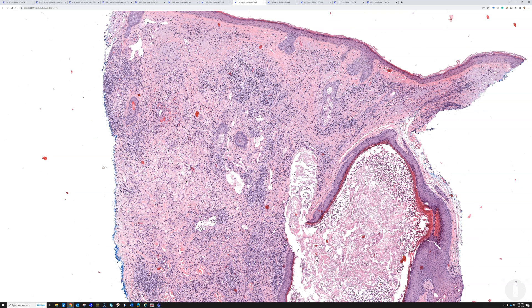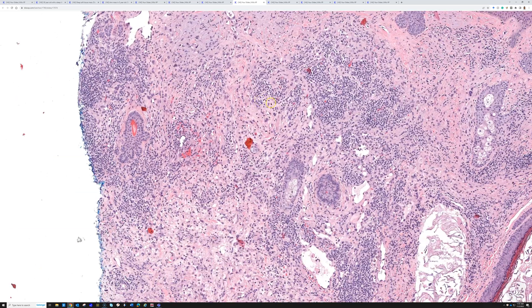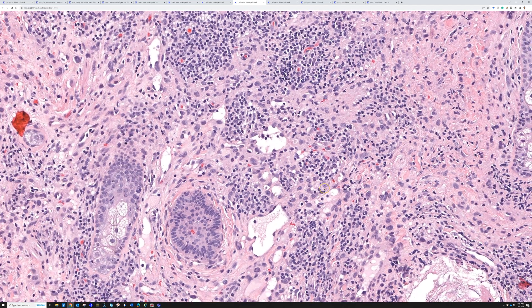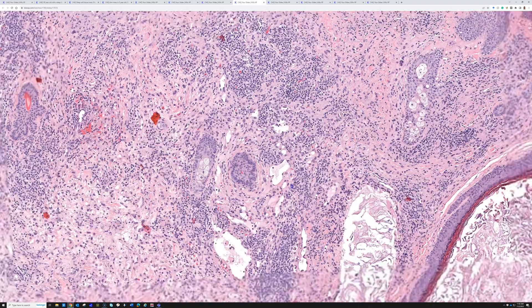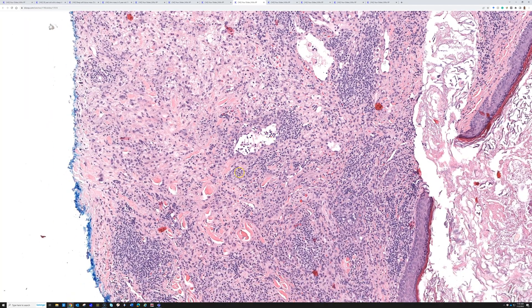I would not be showing you something like a ruptured cyst unless there was more to the story. Looking closer in the background inflammatory infiltrate, we see these enlarged, slightly atypical cells — big, pleomorphic but not very cellular. They look kind of like histiocytes, which you would expect to see next to a ruptured cyst, but something about them is a little unusual. There are also a lot of dilated telangiectasias here.